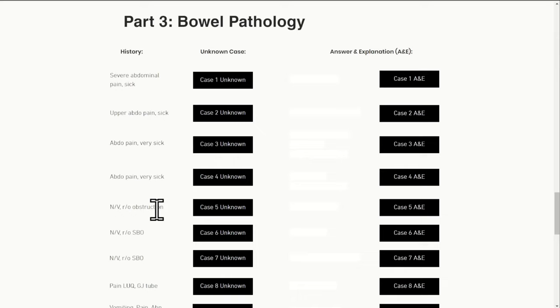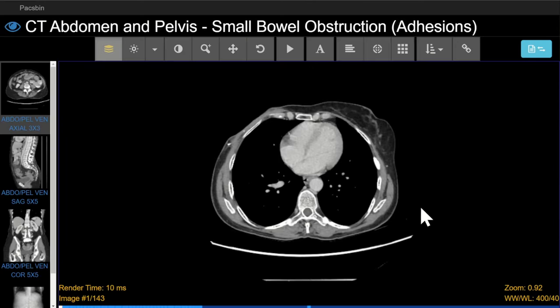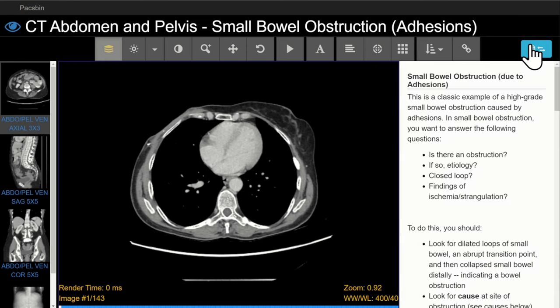Once you've looked at the case in detail, you can click on the answers and explanations link. Here we see the answer across the top — this is a small bowel obstruction due to adhesions. If you click on the blue square in the top right corner of the screen, you'll see an explanation including everything that you need to know, including a walkthrough of imaging findings and some key imaging pearls.